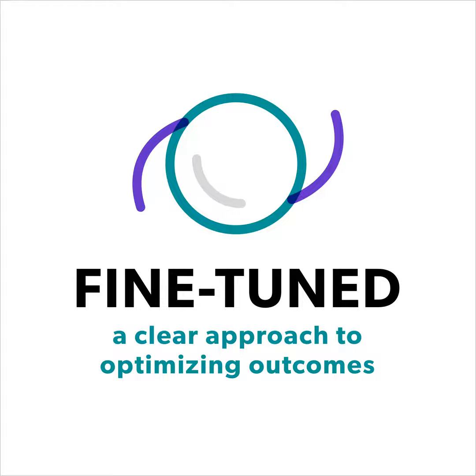All right, so the $10,000 question is always, if a family member needed to have refractive surgery, what procedure would you perform? It depends on the refractive error, but in the vast majority of cases, I would recommend wavefront-guided LASIK surgery. This is the most refined technique with the best clinical outcomes in my hands.